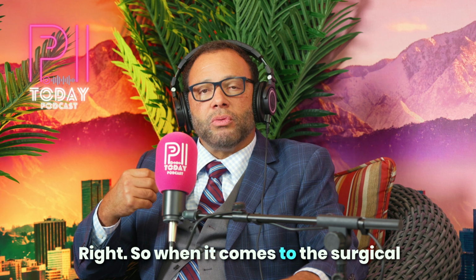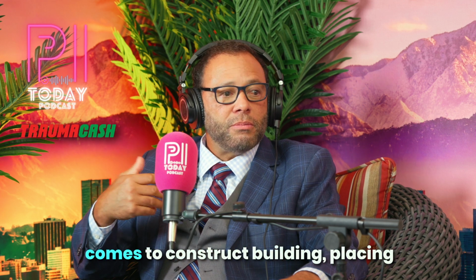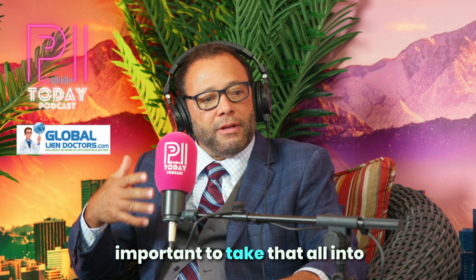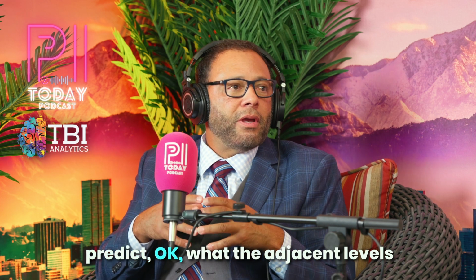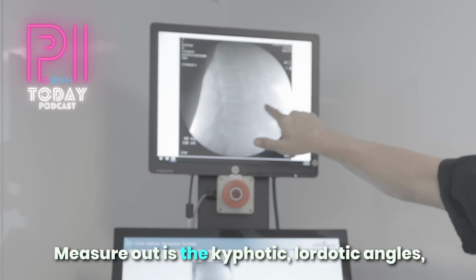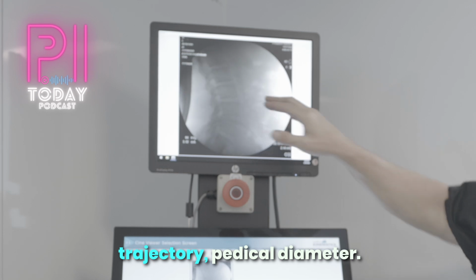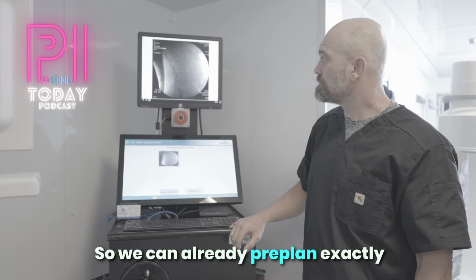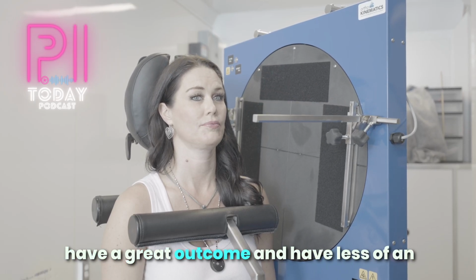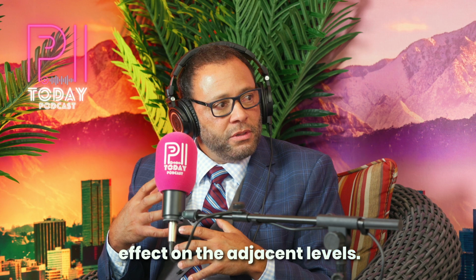So when it comes to the surgical side of treating that patient, and construct building, placing implants in the human body, it's very important to take that all into consideration when it comes to measurement. Because then we can predict what the adjacent levels look like, and also measure out the kyphotic and lordotic angles, trajectory, and pedicle diameter. So we can pre-plan exactly what's necessary for that surgery to have a great outcome and have less of an effect on the adjacent levels. A lot of surgeries end up being revised because of the lack of consideration for sagittal balance.